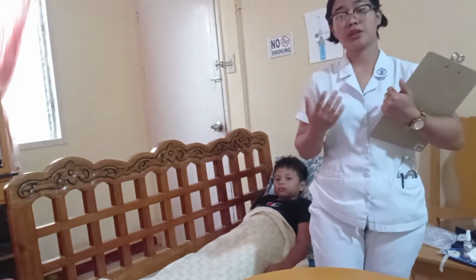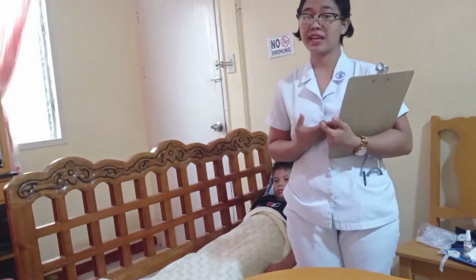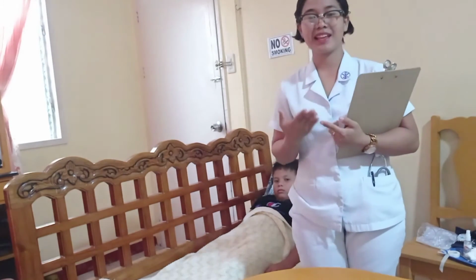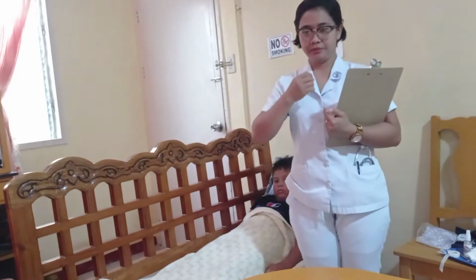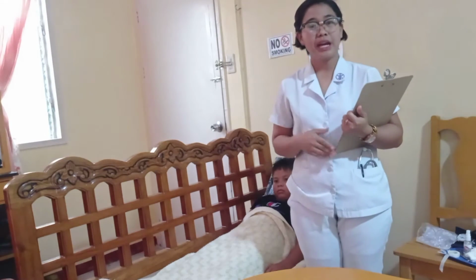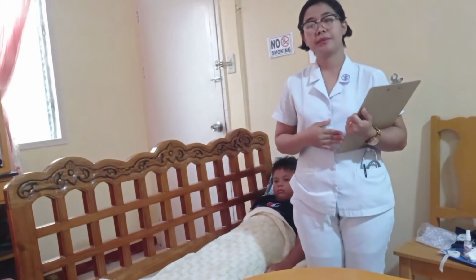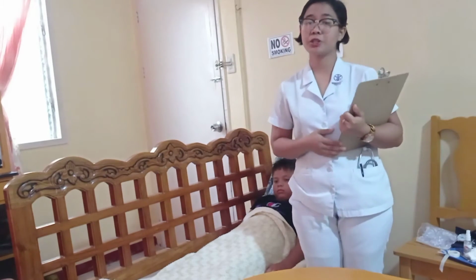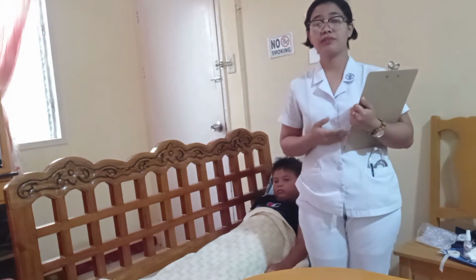Now, the rationale for this is to establish rapport with my patient and also to ensure that the right client receives the right medication. Then, I am going to explain to my client what I am going to do and why it is necessary, and how he would be able to participate during the procedure. It is for him to know what he can do and to have a good flow during the assessment.